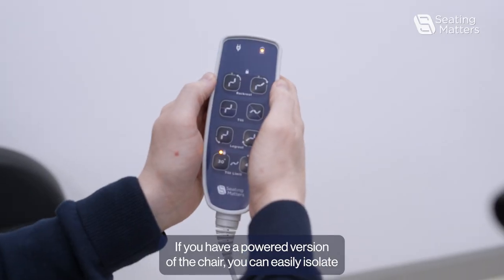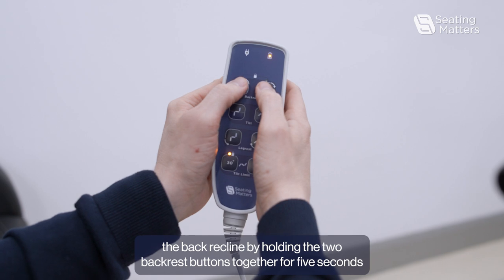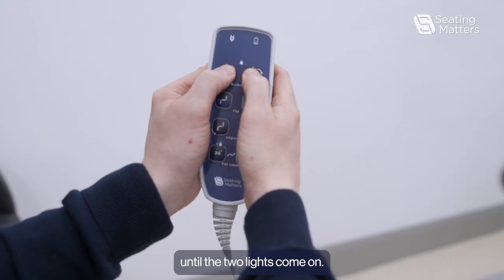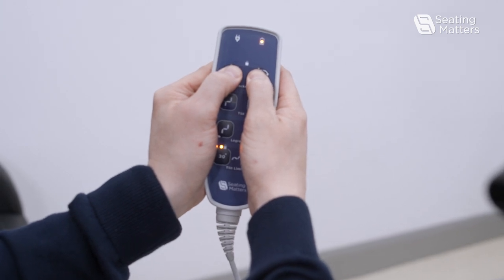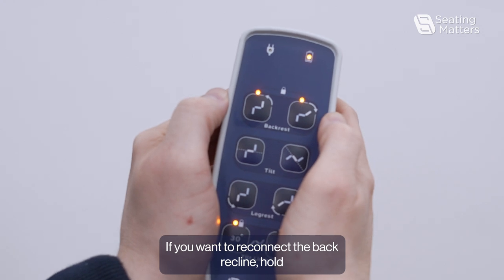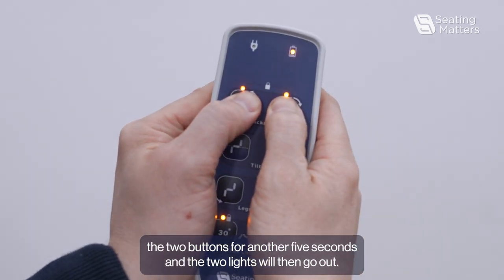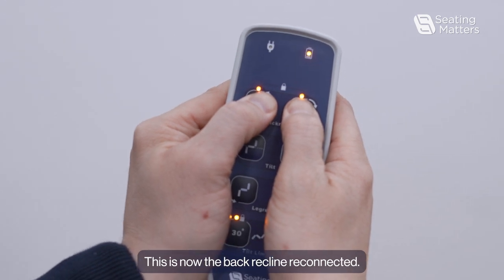If you have a powered version of the chair, you can easily isolate the back recline by holding the two backrest buttons together for 5 seconds until the two lights come on. If you want to reconnect the back recline, hold the two buttons for another 5 seconds and the two lights will then go out. This is now the back recline reconnected.